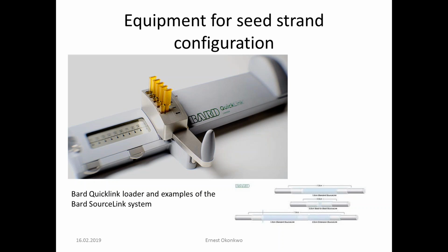There are three possibilities on how one can configure the seed strand: seed space seed, seed to seed, and seed space extended space seed.